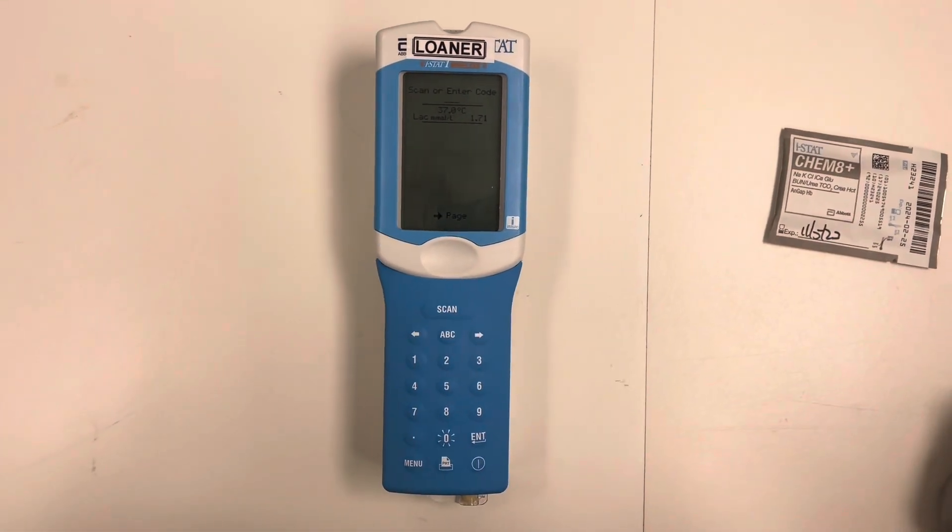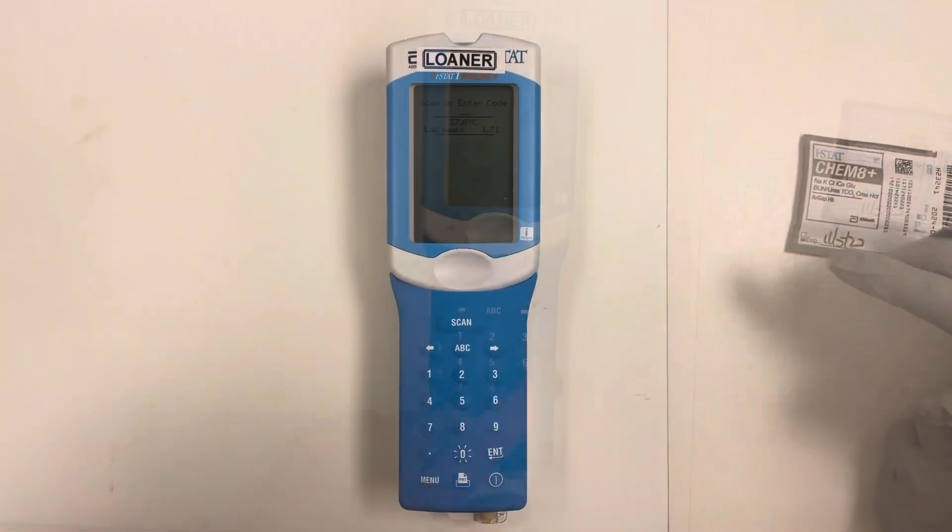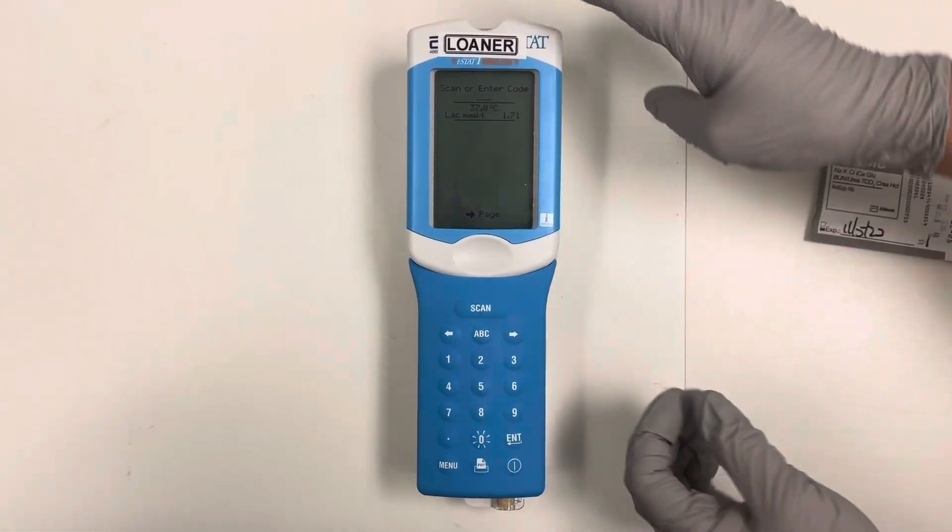It is going to calculate your results. Here we can see it has resulted with a lactic of 1.71. We're going to hit the over button. You have scanner enter comment — that is for a comment code.